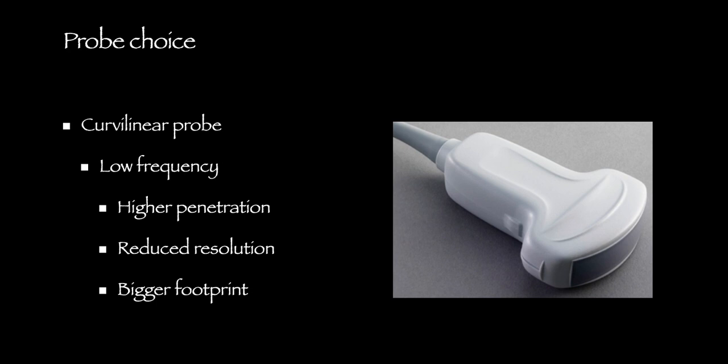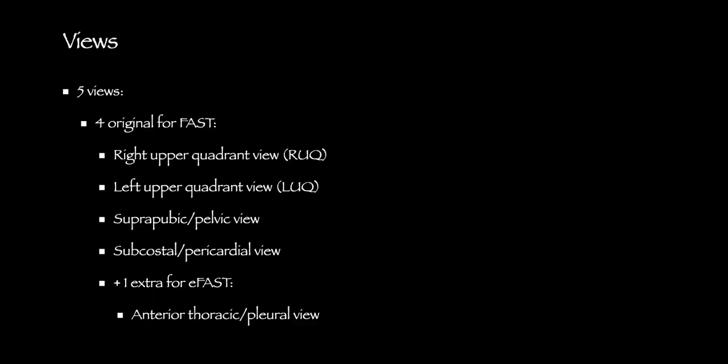This is a low frequency probe that results in higher penetration into the body, but at a cost of reduced resolution, so the picture quality isn't as good. It's got a very large footprint, and that can be tricky, especially in the right and left upper quadrant views where rib spacing can be a problem and obscure the view.